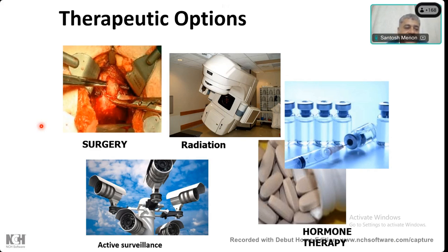Can anybody tell me why I'm showing you this picture? How is it related to pathology and Gleason scoring? Hormone therapy and radiation therapy might change the architecture of the cells and the gland. So once you give radiation or hormone treatment and then do a core biopsy, you may find something completely different from what Dr. Verma was showing in that picture. You may have single cells and you may not be able to give a Gleason grade.